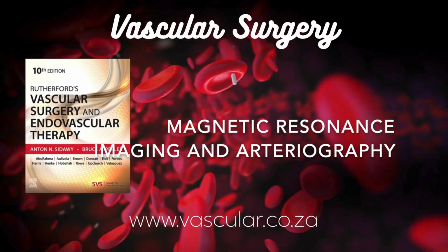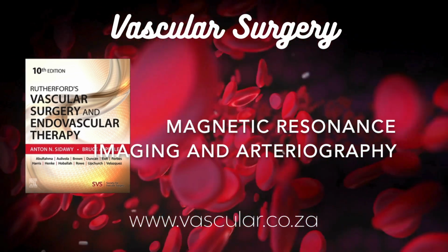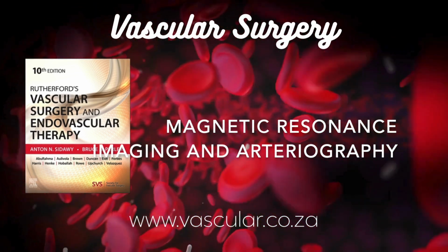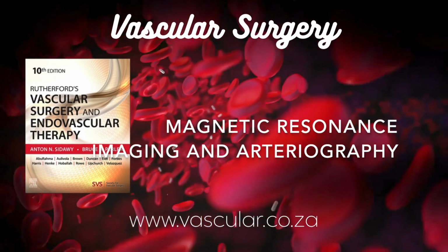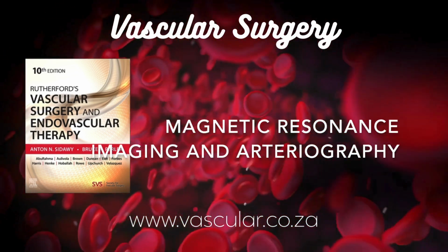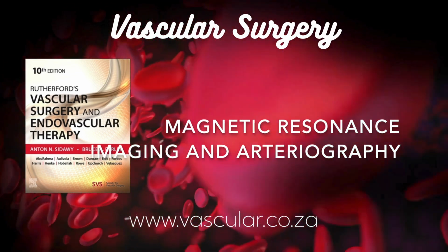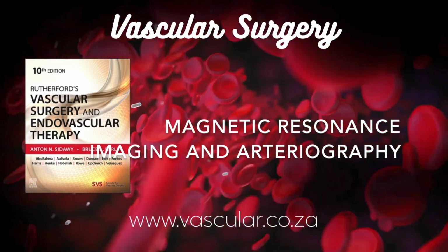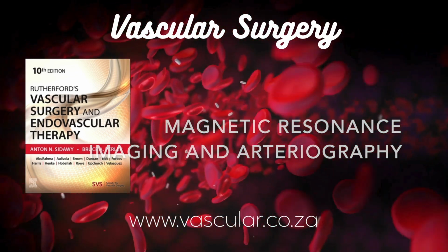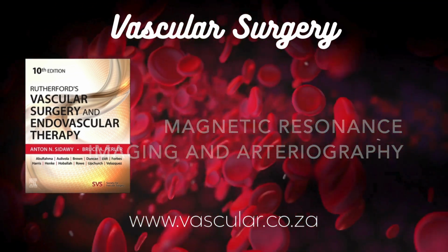Good question. The contrast in MR images, basically how bright or dark different tissues look, depends on two main things: the inherent properties of the tissues themselves and the specific settings, the parameters we use during the scan. T1 weighted and T2 weighted images are kind of the two fundamental types. They highlight different tissue characteristics. For instance, on T2 weighted images, fluids like water or the cerebrospinal fluid around your brain and spinal cord tend to appear very bright. So T2 is good for seeing fluid collections, maybe inflammation?